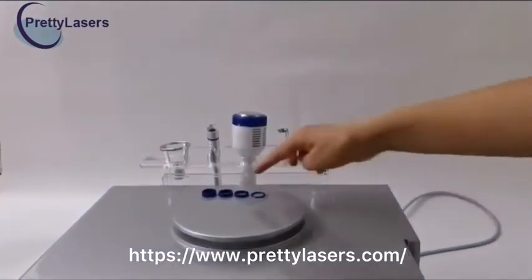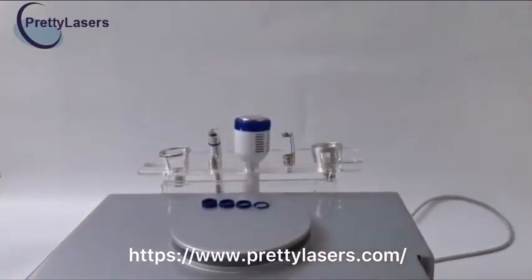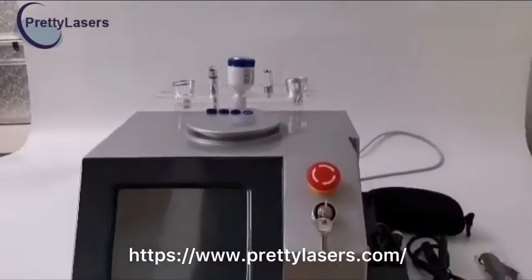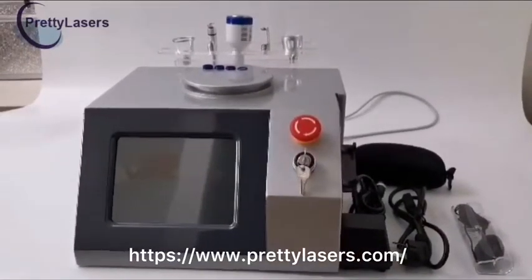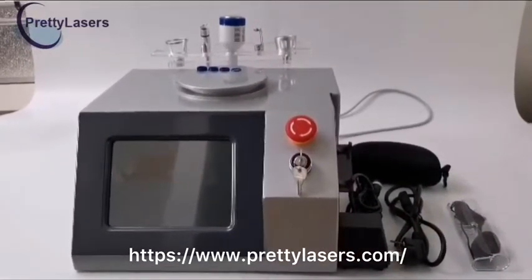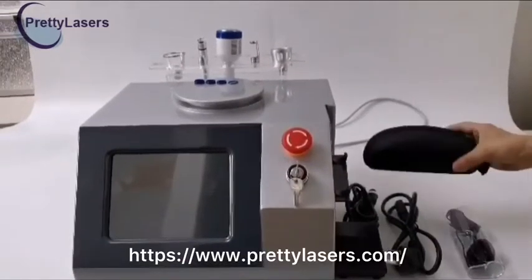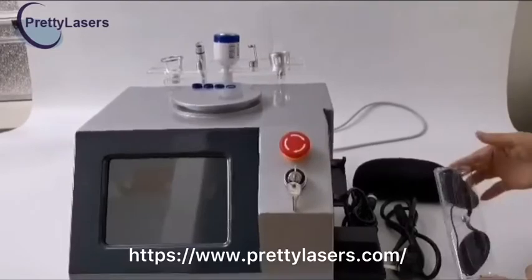This is the focusing unit, used to adjust the size of the spot from 0.2 mm to 3 mm. The tighter the focusing ring, the bigger the spot. This is the laser safety glasses for the operator. This is the eye mask for the customer.